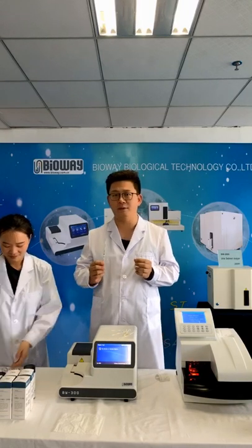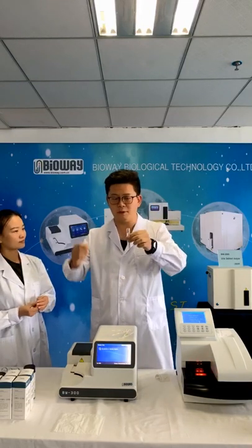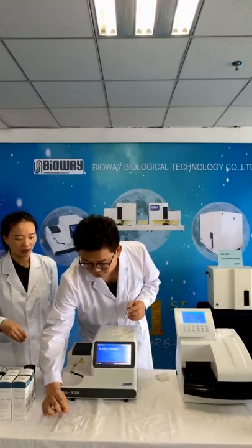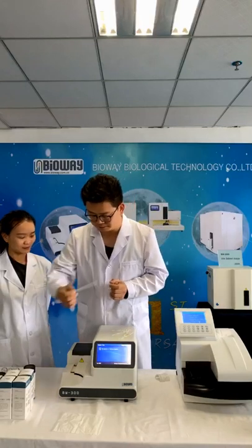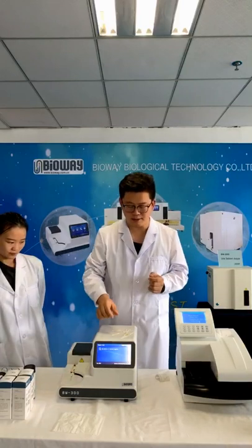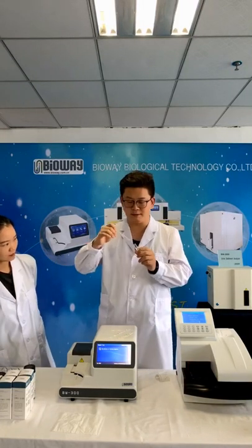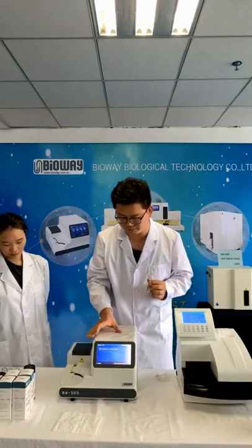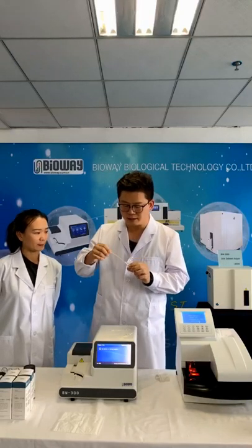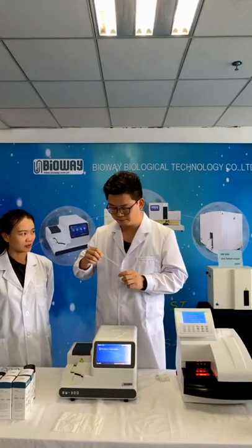Could you give us some advice about how to dip the strips into the tube? Yes, there are some things to be aware of. The first thing: for a urine sample, you have to make sure all the test areas, all the color pads, have contacted the urine sample. When it gets wet, you have to remove the extra liquid, then put it into the testing area. The conveyor belt will transfer these strips into the camera area. Place them one by one, constantly. The faster you put them, the more tests you can get.